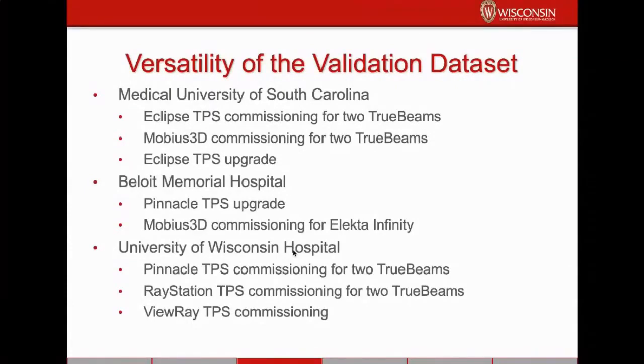plans very quickly. After I graduated from residency, I worked at a community hospital for 1.5 years in Beloit, Wisconsin. Before I had arrived, a group of physicists had measured all of the Medical Physics Practice Guideline 5 validation data. So when we had a Pinnacle treatment planning system upgrade, I was able to use that data set again to validate the new dose calculation in the new version of Pinnacle without having to take any additional measurements. And then a few months later, they bought Mobius 3D, and I was able to commission Mobius 3D using the same data set.